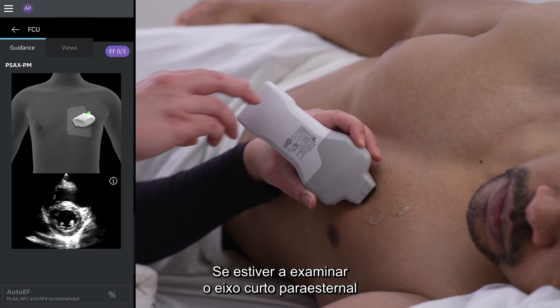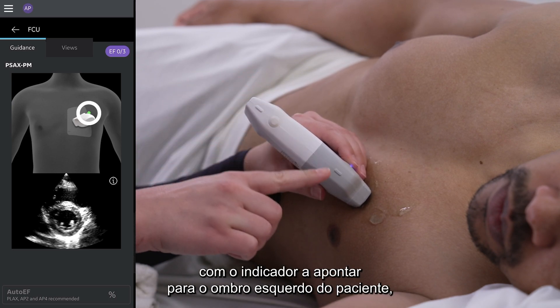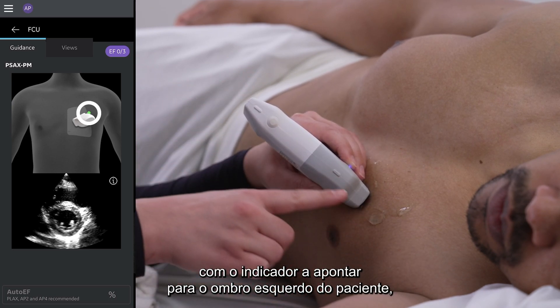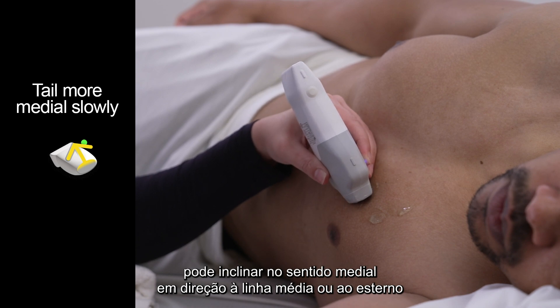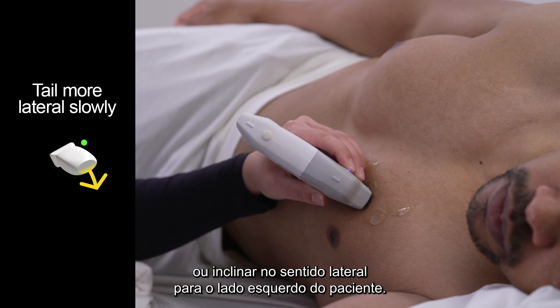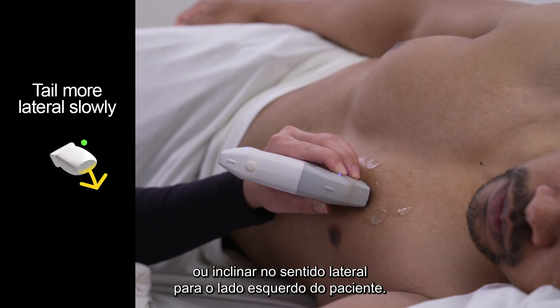If you are scanning the parasternal short axis with the indicator pointing towards the patient's left shoulder, you can tail medial towards the patient's midline or sternum, or tail lateral towards the patient's left side.